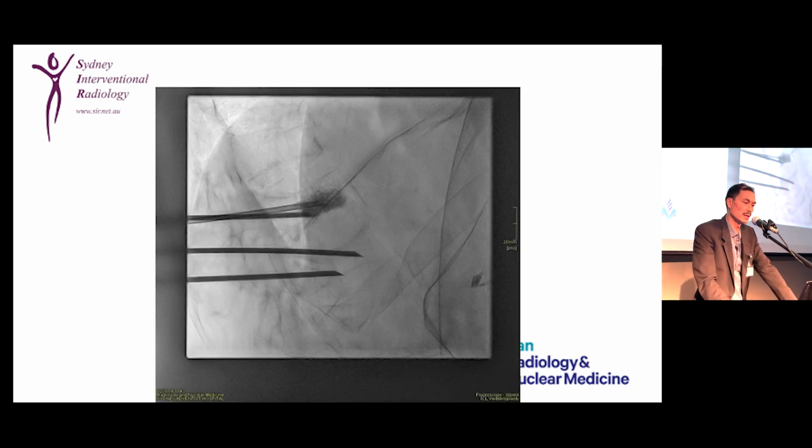So this is a lateral fluoroscopic image of the 4 needles being placed into the vertebral bodies and the cement beginning to be injected in. So 4 needles, the bones are a little bit loosened because she's osteoporotic, and you can see the cement, which is a little bit more hyperdense, getting injected into T12.